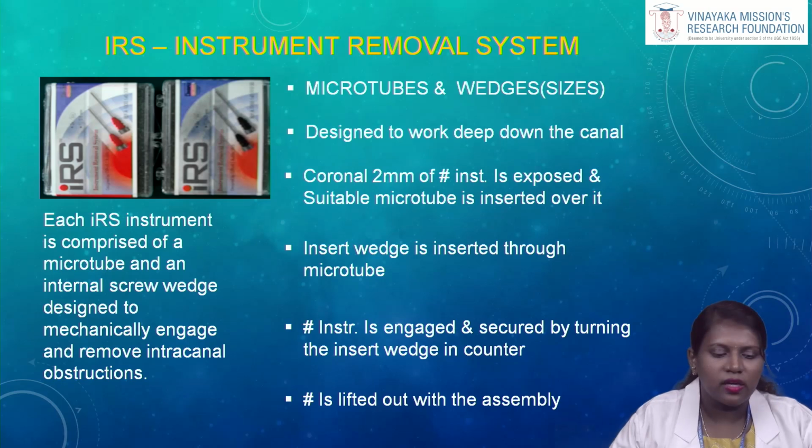The picture depicts the IRS instrument, which comprises microtubes and an internal screw which engages mechanically and removes the intracanal obstructions.